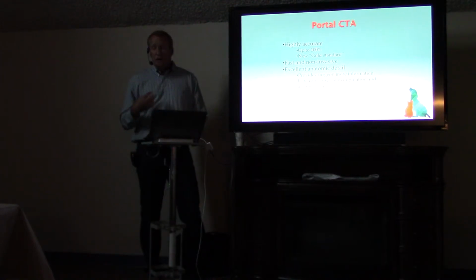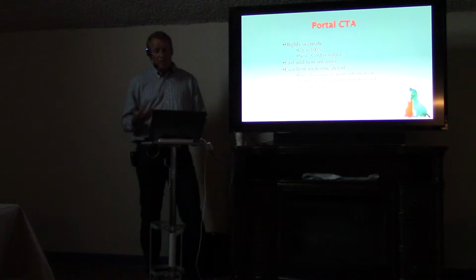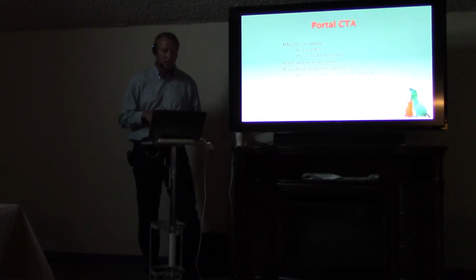It's very accurate, up to 100% accurate in diagnosing portosystemic shunts. It's very fast, it's non-invasive, and it provides great detail of the shunt, what kind of shunt it is, and where it's going, which might provide more information to the surgeon, which could benefit with decreased soft tissue manipulation and decreased surgical time.